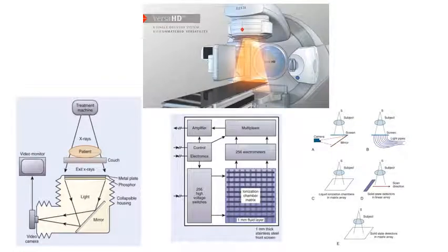This picture shows the position of the megavoltage or MV detector, as it is known, as well as some of the configurations that have been used in commercial systems. It deploys directly in the beam, distal to the patient.